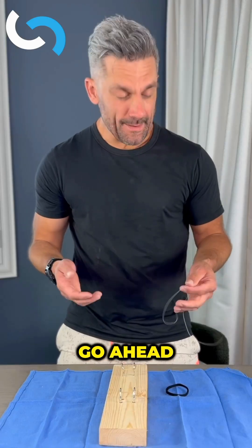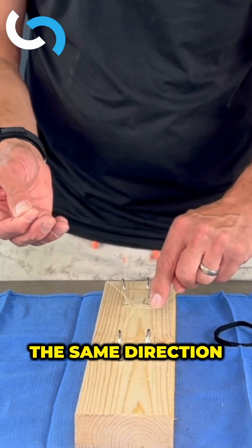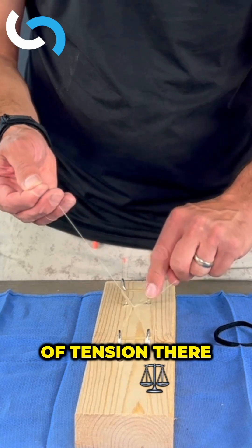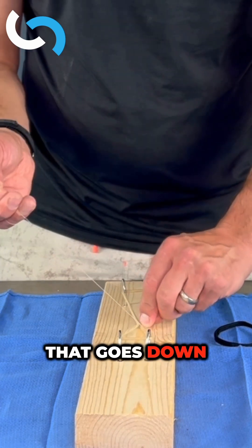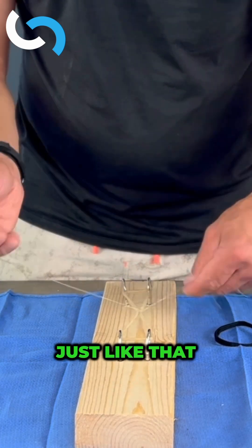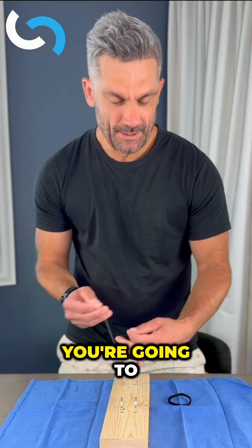Once you get that set up, go ahead, grab some suture, then start out two throws in the same direction. You can see there's a little bit of tension there. Got to make sure we're not going to tie an air knot. That goes down. Practice. And then when you get to the OR, you're going to be nice and smooth.